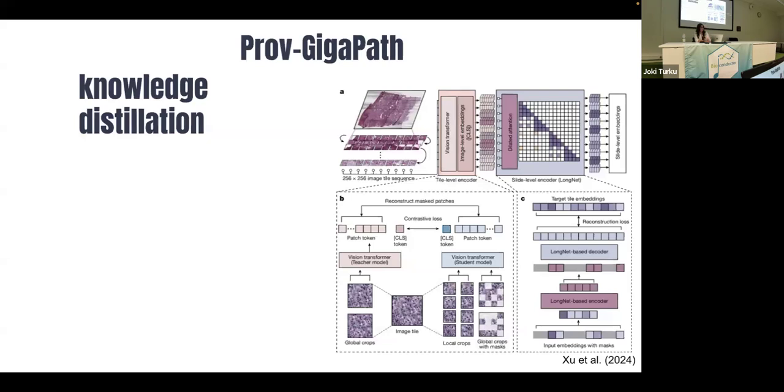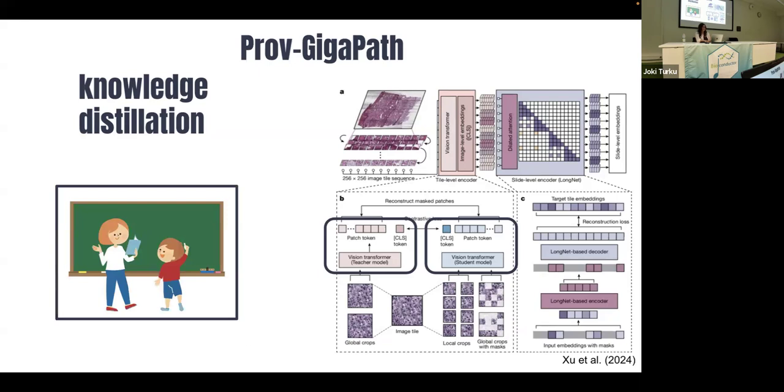In this model, there is something very interesting, which is knowledge distillation. This was proposed by Geoffrey Hinton in 2015. Here you have the teacher model and the student model. Inside this foundation model, you have this kind of relationship across these two models, because the teacher model was trained on billions of data, and the student model is just trained on the output of the teacher model.